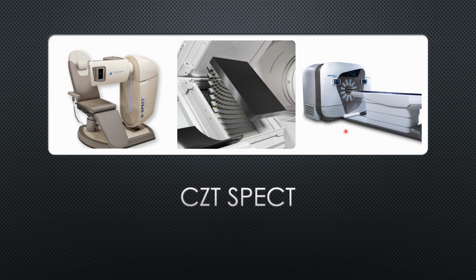And on the right, we see these finger detector CZT systems. Here it's the Veriton system from Spectrum Dynamics. The GE system is similar. But you can see we have these fingers, and at the end of each of these fingers, there's an array of CZT detectors for us to capture the imaging information.